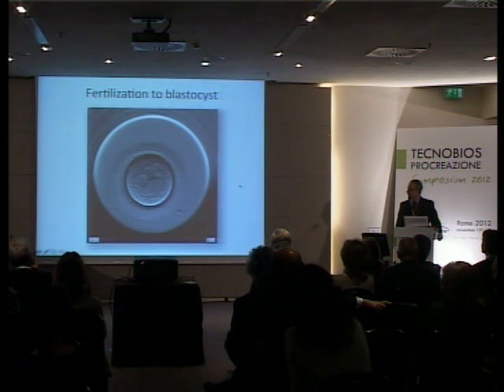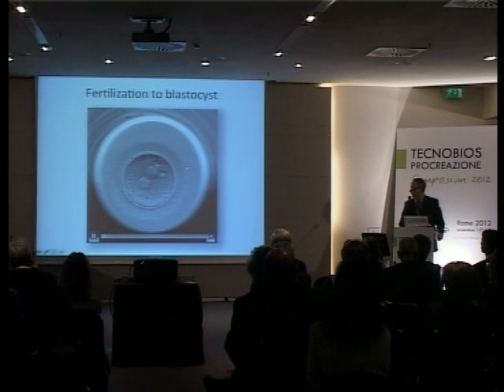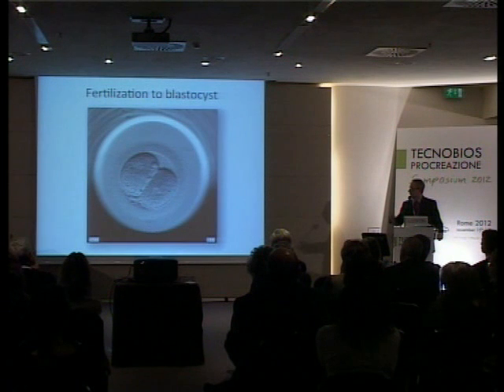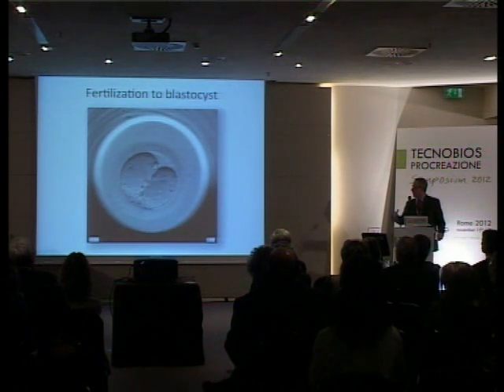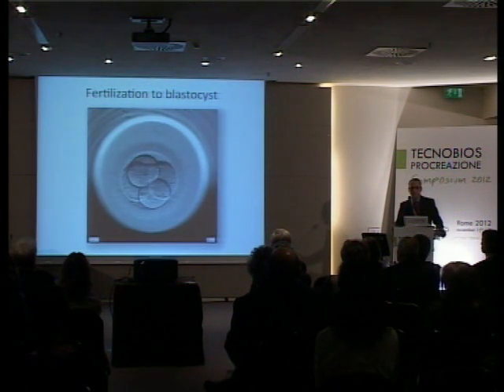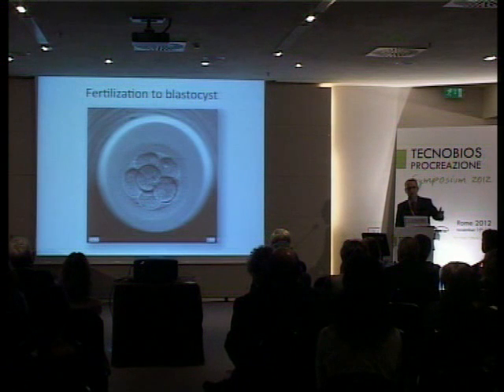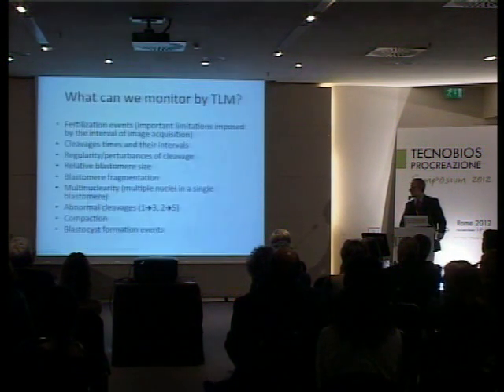You've probably seen a number of movies, so I will not run the entire video, but this is just to emphasize how by time-lapse microscopy we can observe a number of phenomena that would be missed with ordinary observation, especially in terms of allocating a specific time to a specific event.